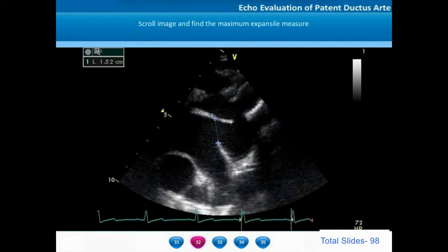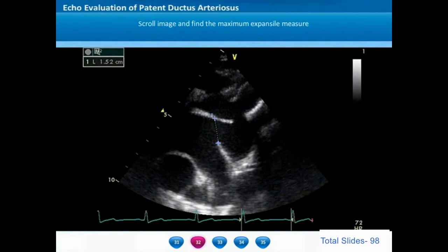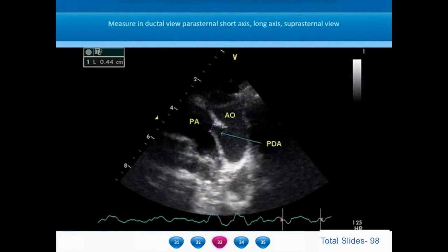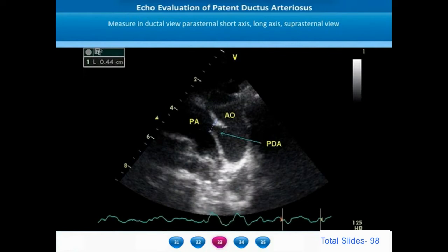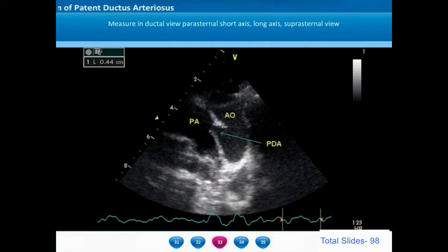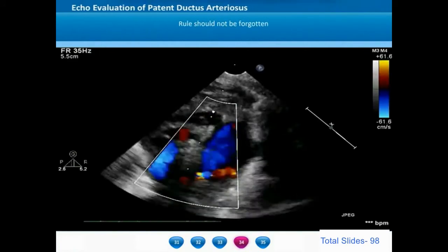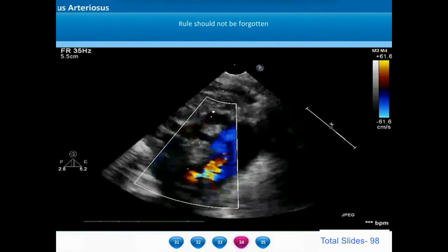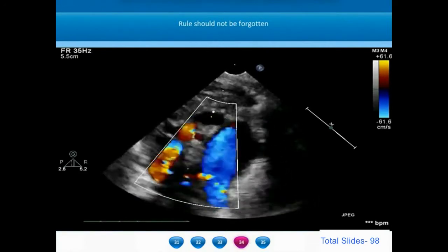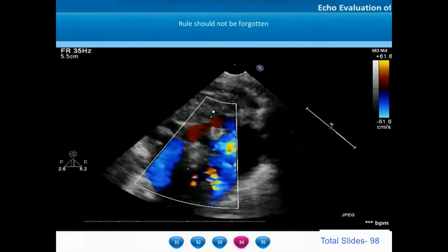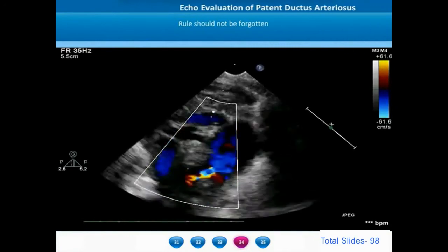The measurement of ductus arteriosus is done primarily in three views: the parasternal long axis ductal view, measuring from the upper to the lower end at the pulmonary end, and the suprasternal view. Any ductus arising from the left aortic arch at the junction between the arch and descending thoracic aorta and inserting into the pulmonary artery bifurcation should be clearly seen on the ductal views and suprasternal ductal views.